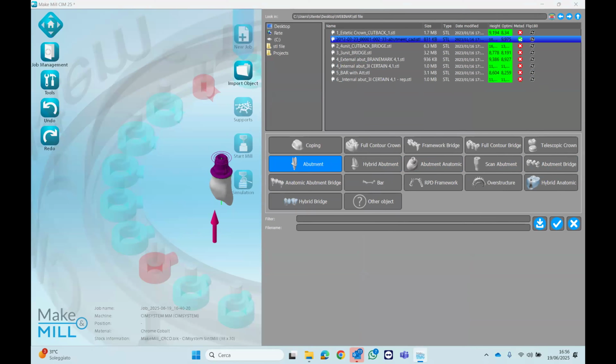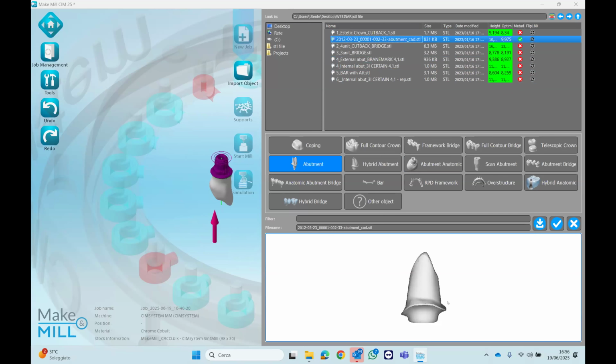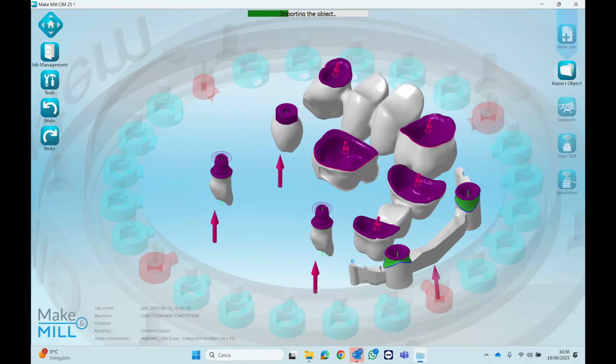Because inside the construction info, you have the information that you will need to export and put inside a folder, in a reference file, where you will write the exact name of that connection and match it with your replace. I already did that, but once you do that one time, it's always good. So when you have that type of connection, all you have to do is give it okay, and it will automatically change the connection without you having to do it manually.